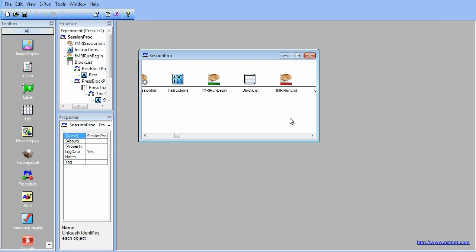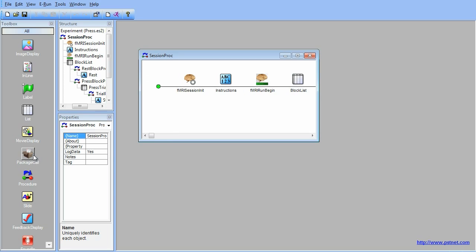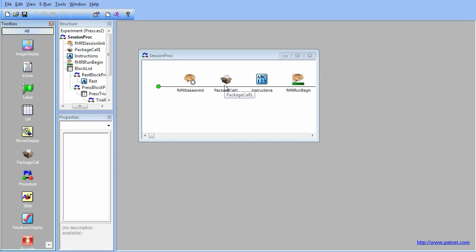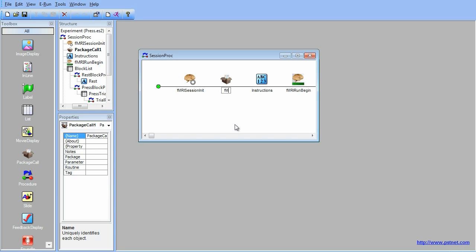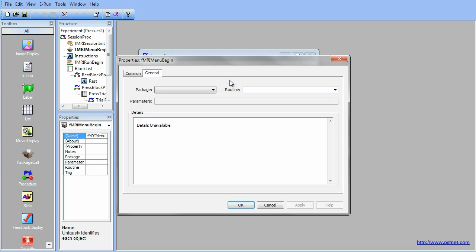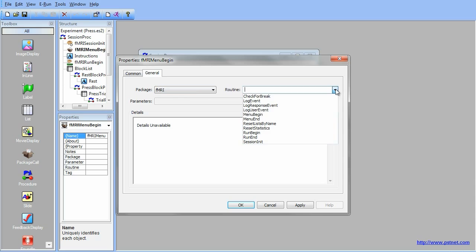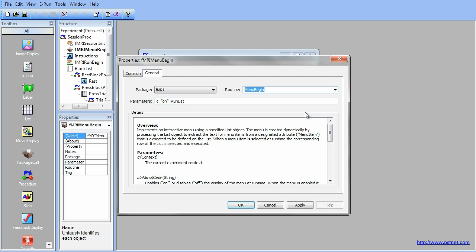fMRI experiments sometimes require menus. To do that, we will add a few menu package calls as well as changing a few things about the experiment structure. First, you will need to add the fMRI menu begin package call. Drag a Package Call object from the Toolbox and place it after the fMRI session init package call previously added. Rename it fMRI menu begin. Open the Package Call Properties page, change the Package drop-down to fMRI and the Routine drop-down to Menu Begin. This package call searches for information used to populate the menu that it creates. Click OK to accept the changes.